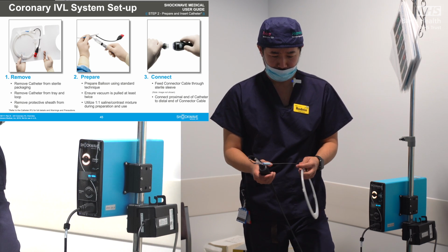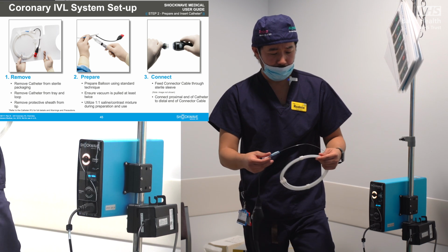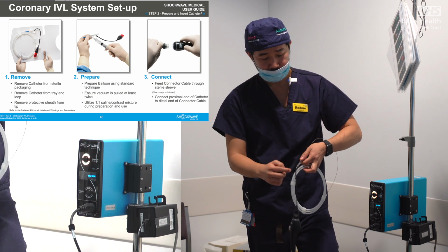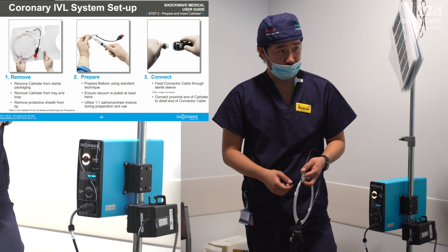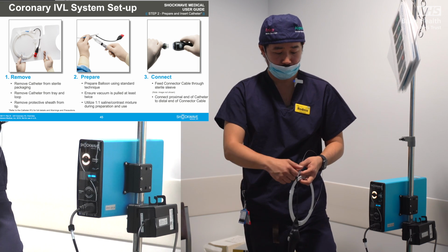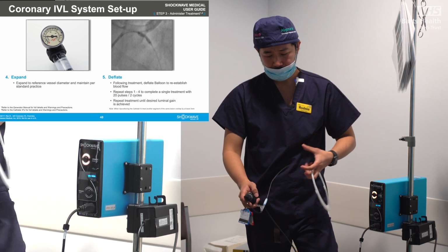So it's a normal balloon. Before it was over the wire, but now they changed it to just a monorail. It has only 1 port, and that's where your inflator goes. And then standard balloon prepping, 50-50 contrast. You connect and then you negative prep, and that's it. Very simple.